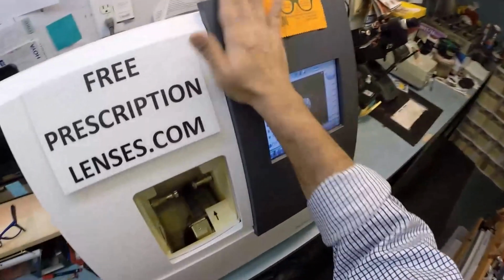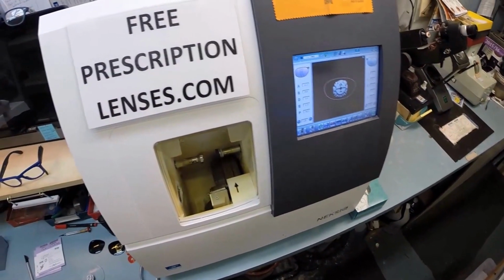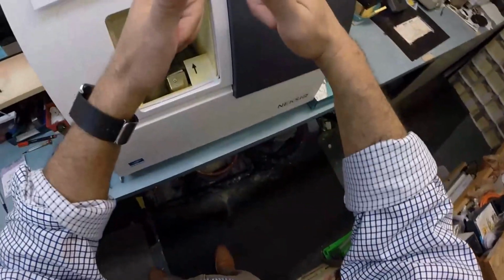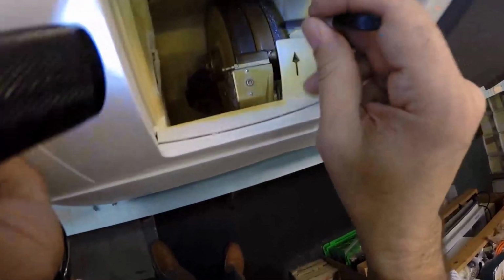Now this is the edger. This is what costs $40,000. It weighs 200 pounds. I recommend everyone go out and buy their own. Then you won't need this guy anymore to cut lenses for you. But the actual cutting wheel is over here on the far right for now. It's going to move to the center when it's working. But it's going to act like a heavy grit sandpaper to grind away your lens material.